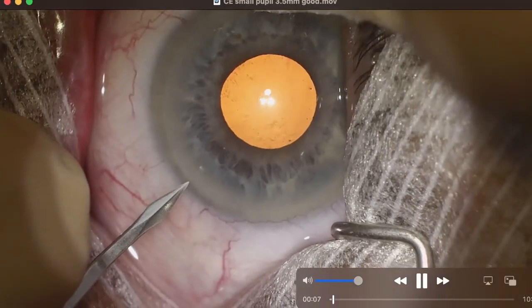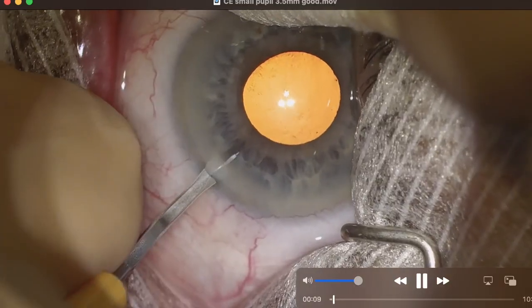Hi, Mohamed Elmala here. I wanted to show a case of how I manage a small pupil.